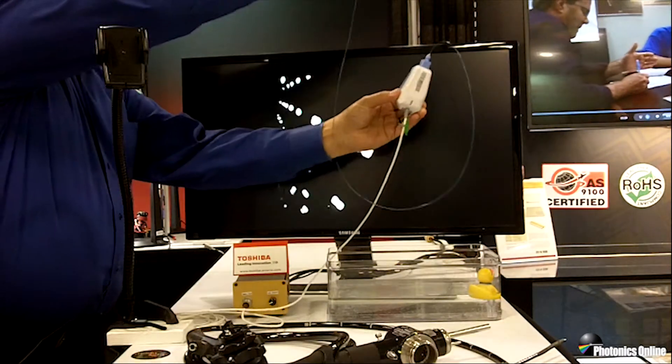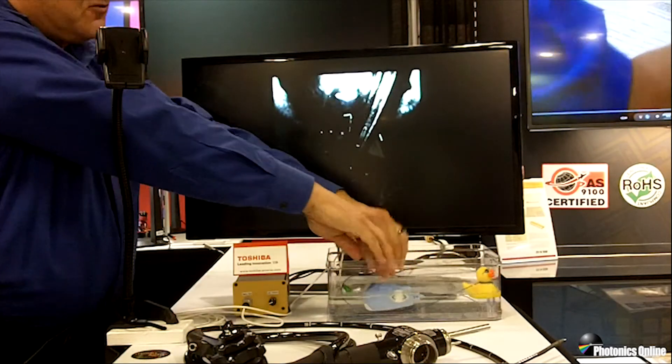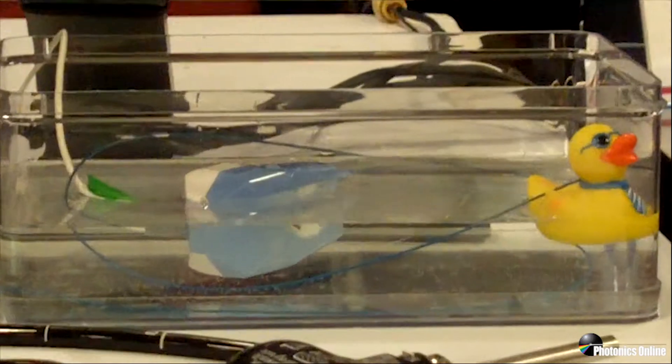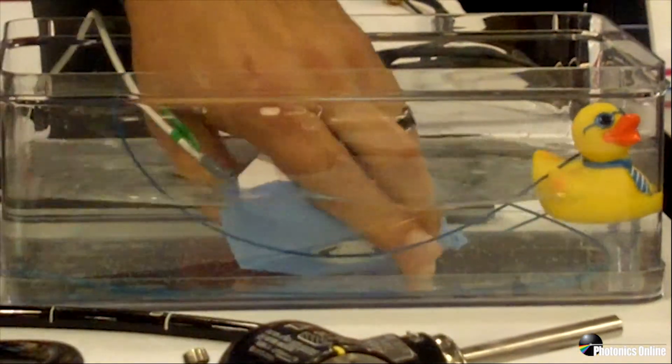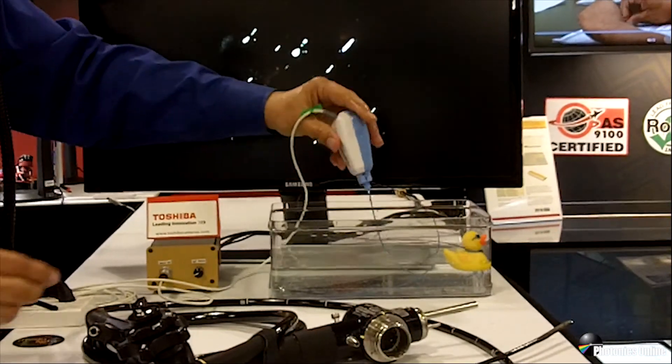We've designed the SV-1000 to be completely submersible so we can put it into a disinfecting solution for cleaning all the way to the connector at the camera control unit. This is another advantage, making service and use of the SV-1000 as easy and convenient as possible.